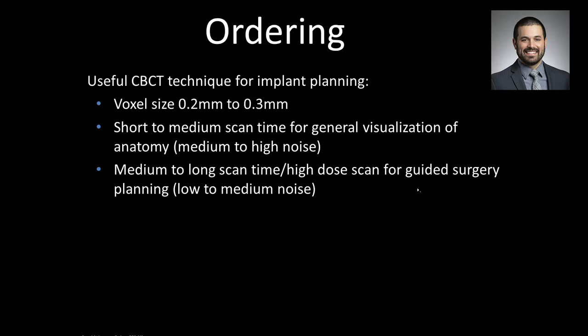If we are going to do a guided surgery, the requirements change a little bit. You want a nice crisp image to end up fusing that guided surgery with, for example, a scanned impression or intraoral scan, and build a guide, tooth borne or tissue borne, for example, to that data. So the noise requirements, the image quality requirements get quite a bit higher. And so we will commonly elect for a medium to long scan time where we use a little bit higher dose for the patient, but we get a lower to medium noise.